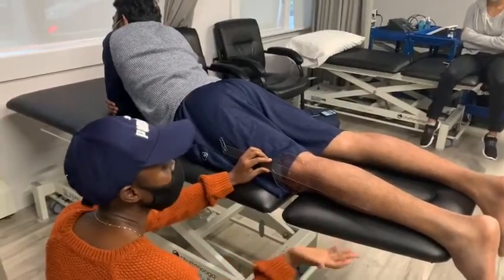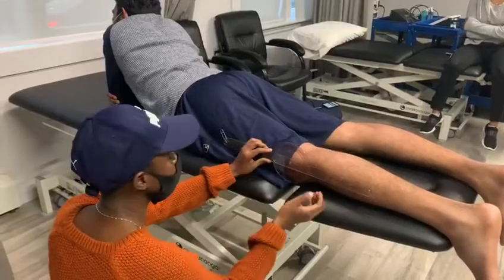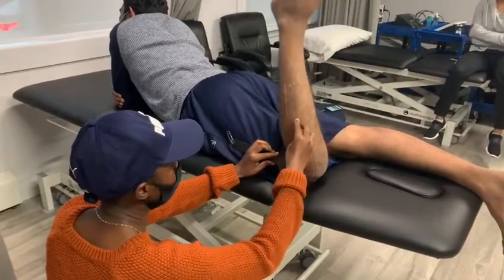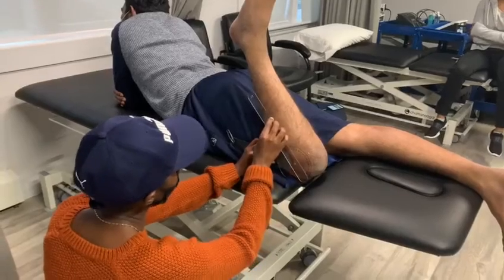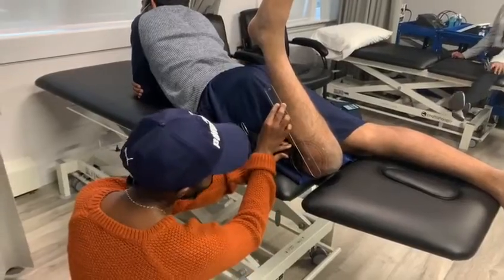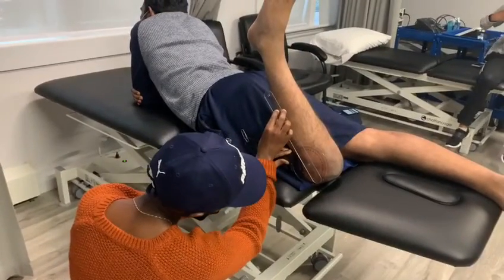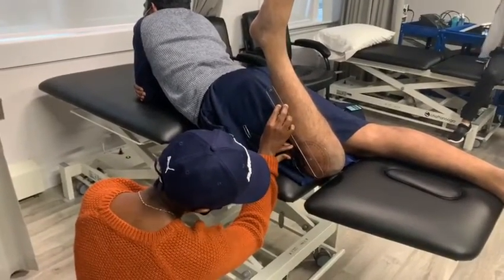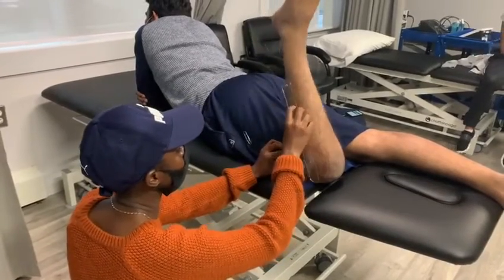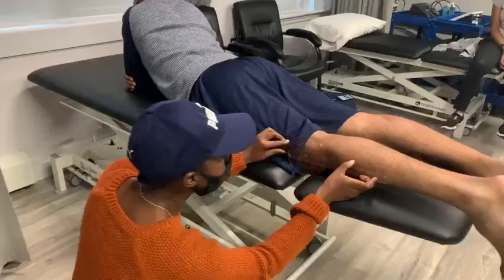I'm going to ask you to bring your heel up. The normal range should be 135 degrees. Is that as far as you can go? Yeah. Any pain? No. And we see here that he has 132. You can come back. So that's within the normal range.